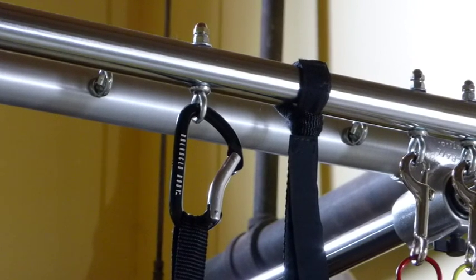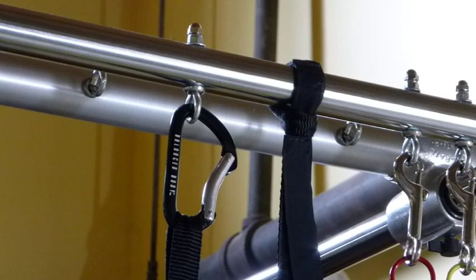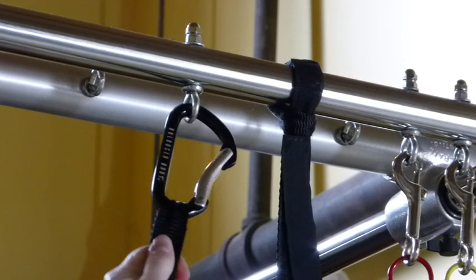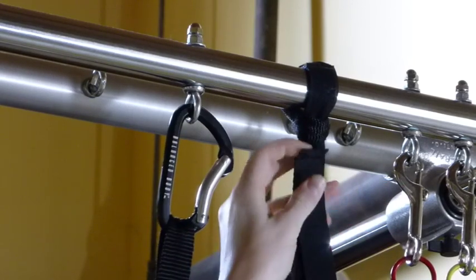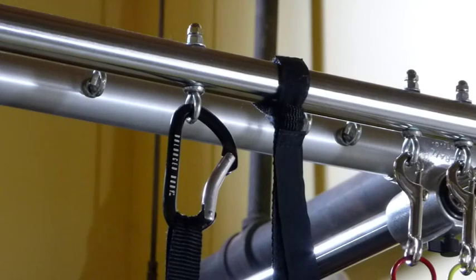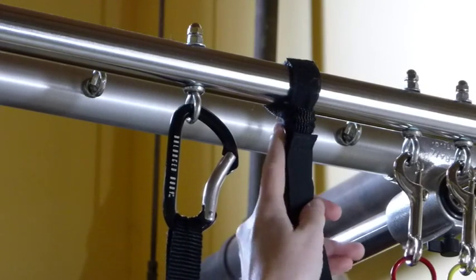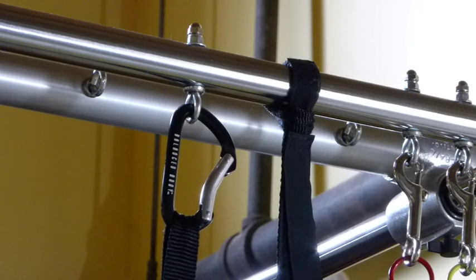Next, you need to check all of your loops, handles, and your safety strap. Your safety strap is especially important. You want to give it a nice little tug and make sure that you don't see any frays or anything that could keep tearing and cause it to break. This one has a little bit of fuzziness on it, that's fine. We just want to make sure that there are no cuts or threads coming loose. Make sure you check your handles and loops also.